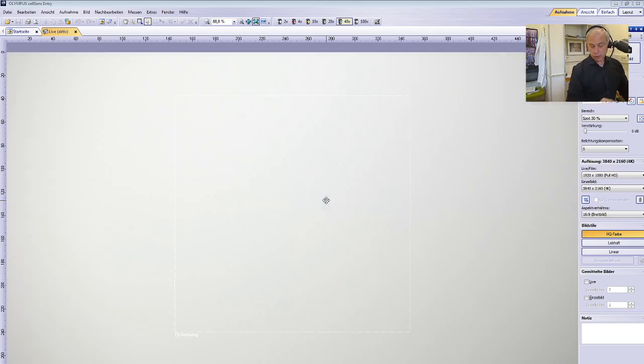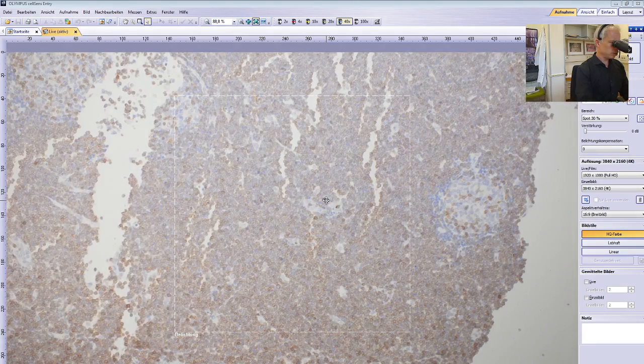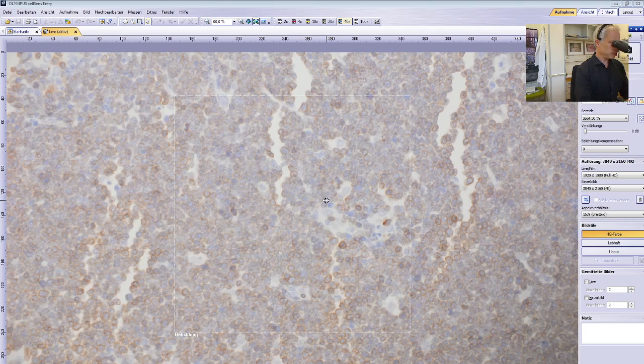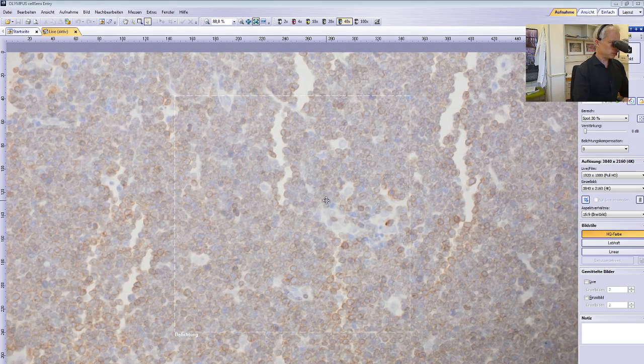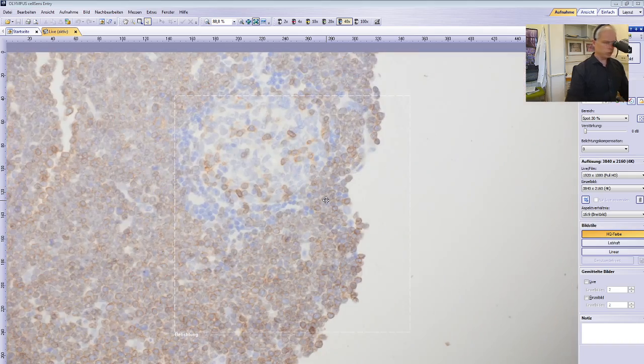The next step in the diagnosis would then be to check each line of differentiation. We always stain all these lines. The first thing we stain is CD3, and you see here that CD3 is faintly positive on these cells. It's not possible to distinguish membranous from cytoplasmic staining by immunohistochemistry. We have known this for a long time; it is possible by flow cytometry, not by immunohistochemistry.